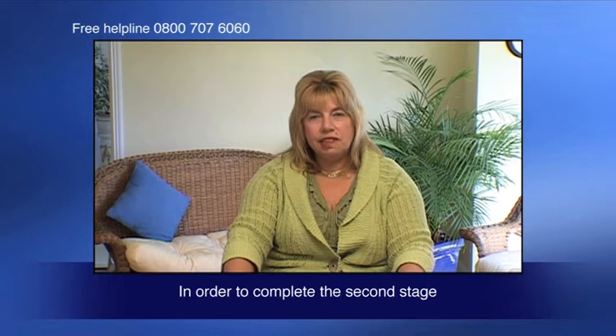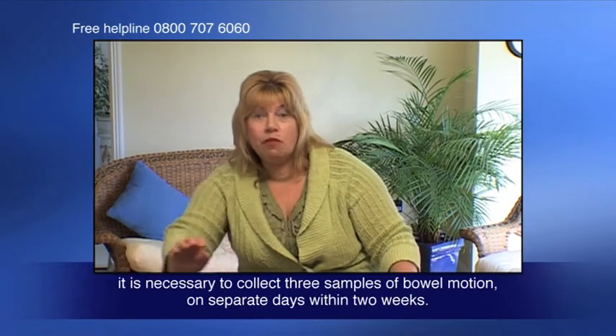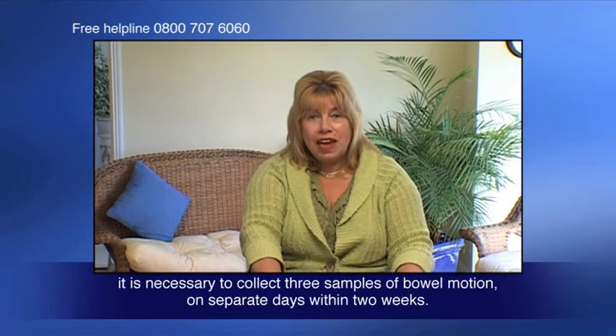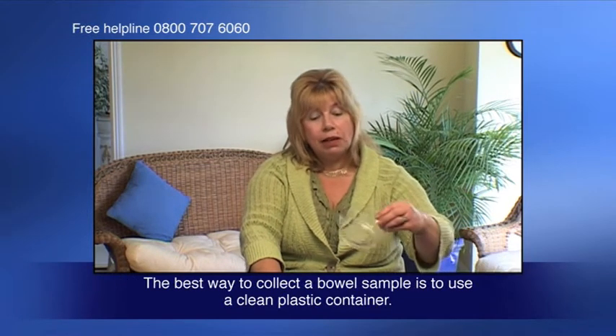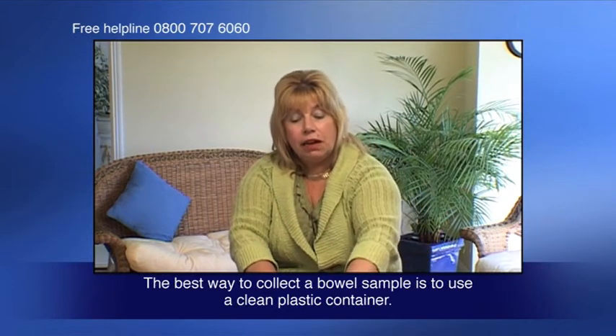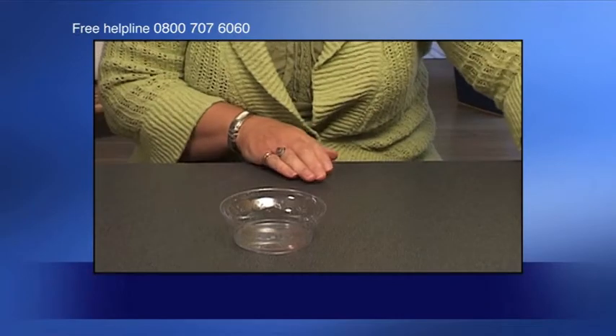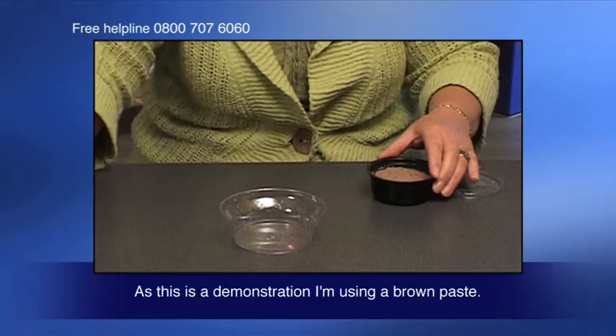In order to complete the second stage it is necessary to collect three samples of bowel motion on separate days within two weeks. The best way to collect a bowel sample is to use a clean plastic container. As this is a demonstration, I'm using a brown paste.